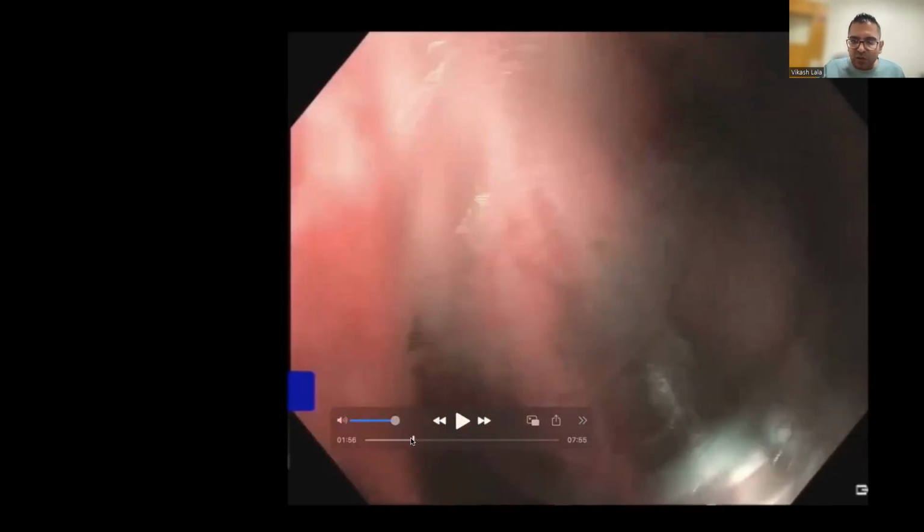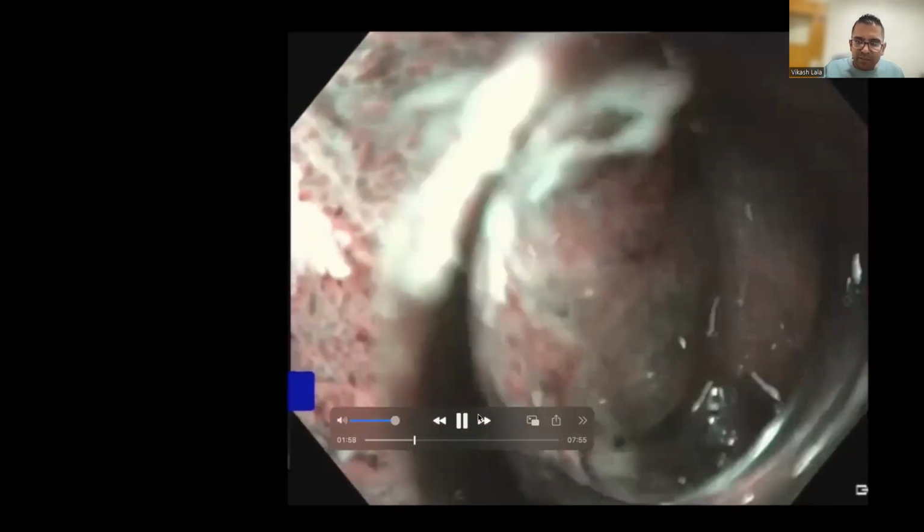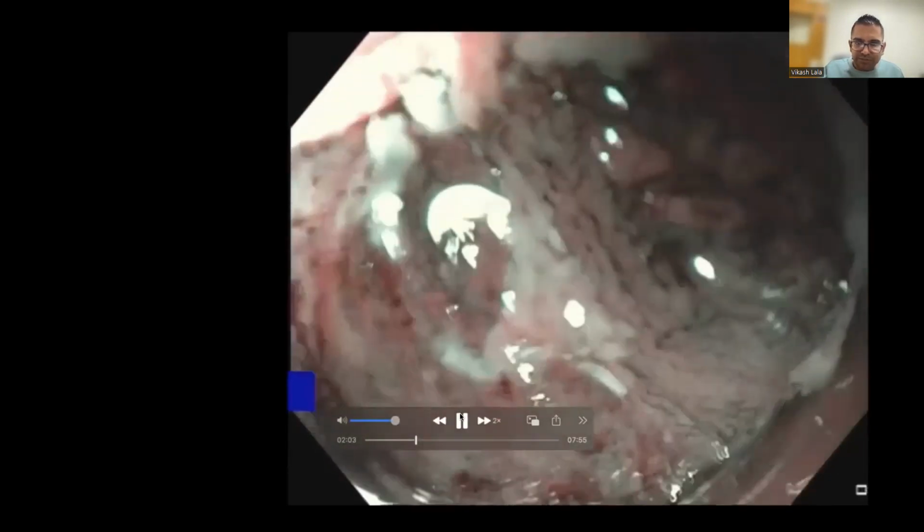And again, there you can also see that there is a demarcated area here in the center. It's different from that area. It's irregular, but there still is a bit of structure in there. I'm just going to move a little bit forward there. I think there's a better view that I managed to get at some stage.